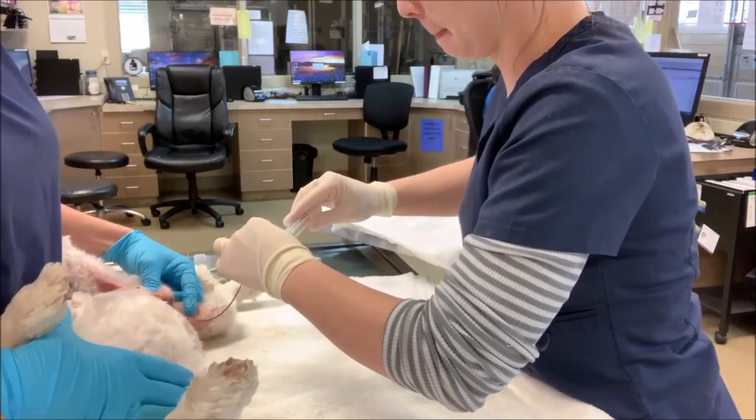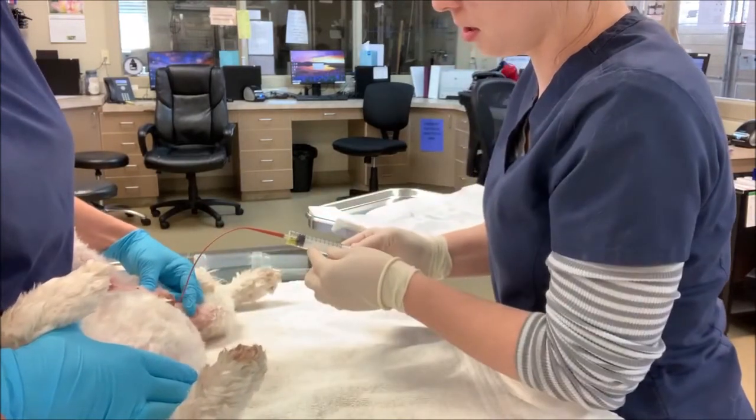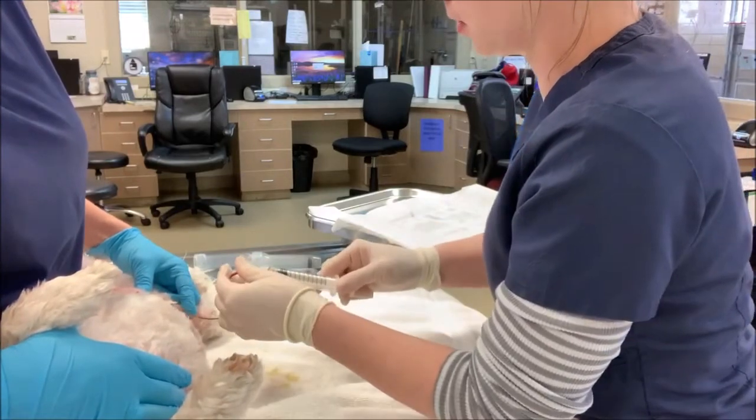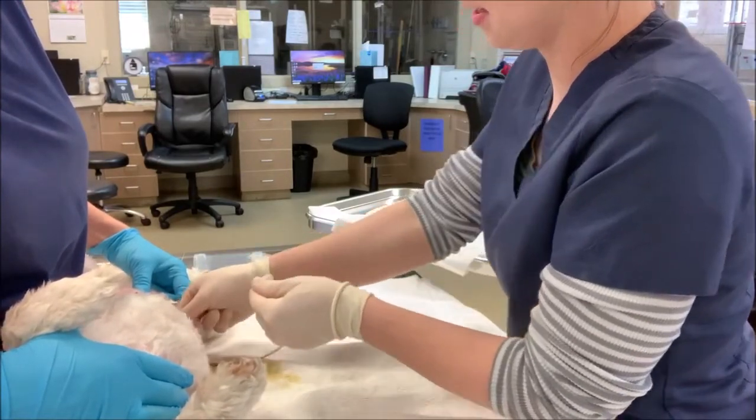So we have urine flow, I can go ahead and pull a little bit of urine to get my sample, and then when I pull it out, I occlude it, and pull gently straight out.